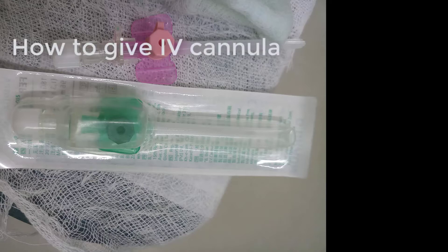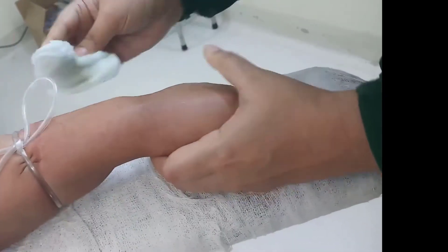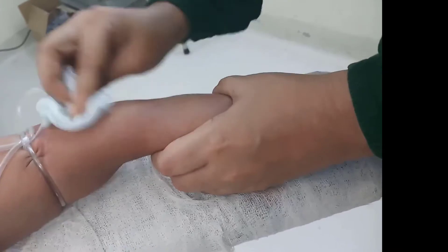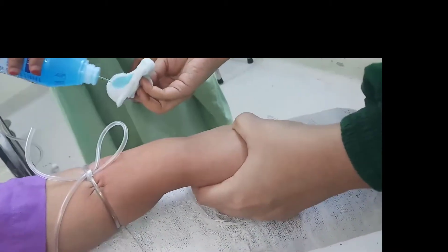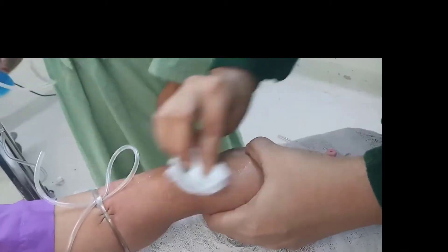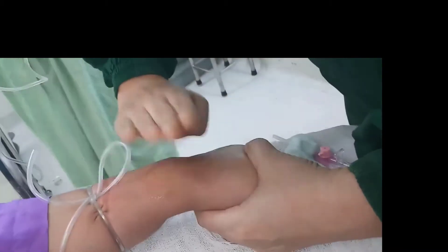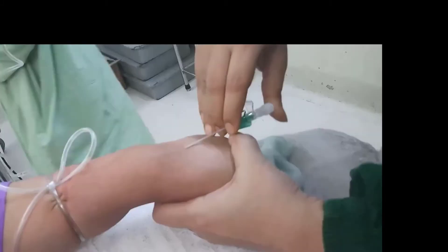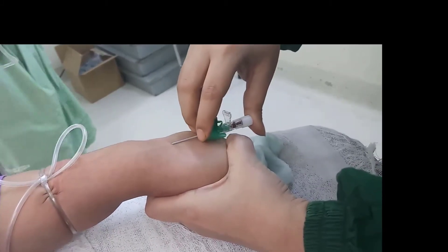In this video we will show you how to give IV cannula. At first, a tourniquet is given in the arm, then the vein is made prominent by making a fist. Then the hand is washed with hexisol and the vein is made prominent by tapping, and then the IV cannula is introduced.